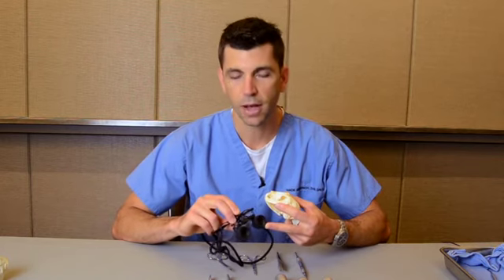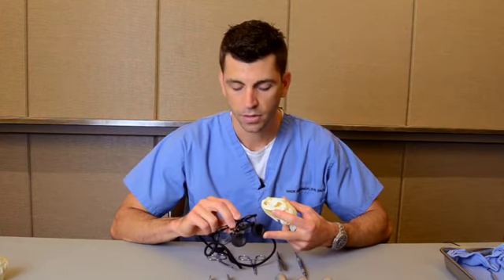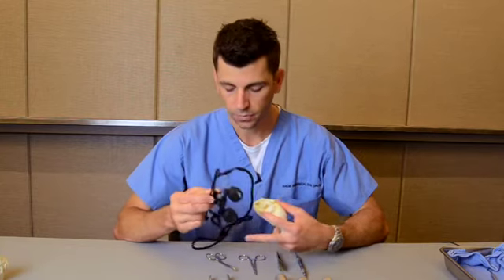I use a 2.5 magnification. That's probably the most universal type of magnification that you could have in magnifying loupes. Some people would prefer stronger magnification, such as a 3.5 to 4.5 strength, but I prefer the 2.5. It also gives me a little bit wider field of view.